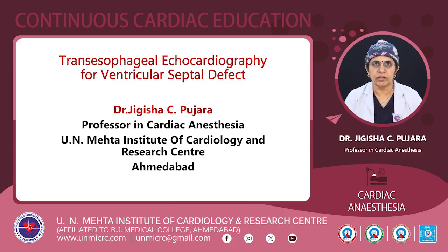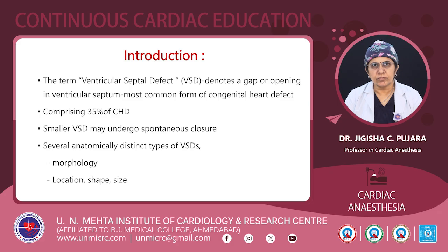Herewith I am presenting transesophageal echocardiography for ventricular septal defect. The term ventricular septal defect, VSD, denotes a gap or opening in the ventricular septum, the most common form of congenital heart disease, comprising 35% of CHD. A smaller VSD may undergo spontaneous closure. A larger VSD is required to be addressed either surgically or by device closure.